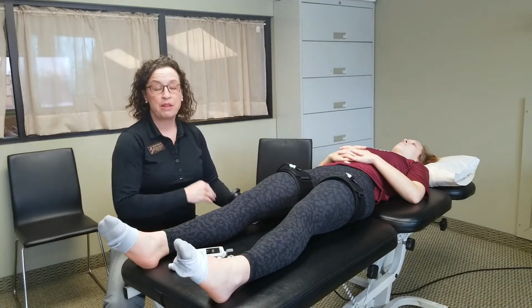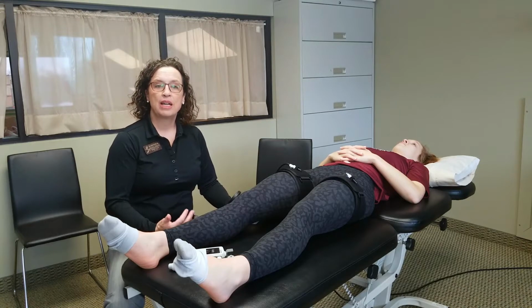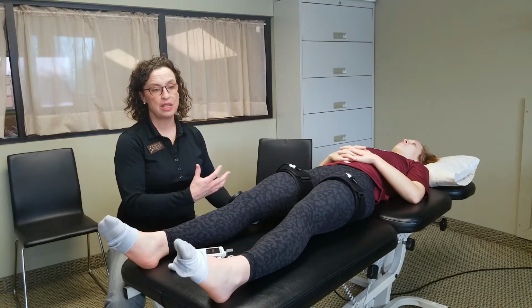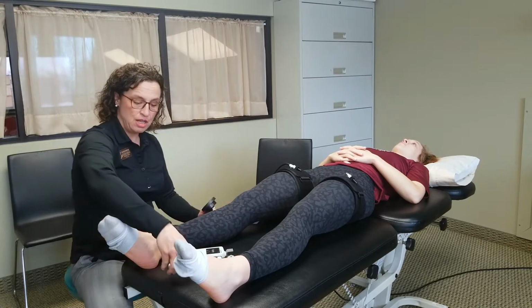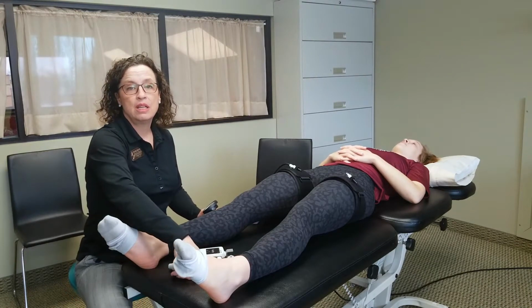But blood flow restriction therapy has been around for about a decade in the bodybuilding community and has recently been converted and researched for the medical community. And there's some great research we'll talk about as Rachel starts to exercise that really supports the use of blood flow restriction therapy in rehab.